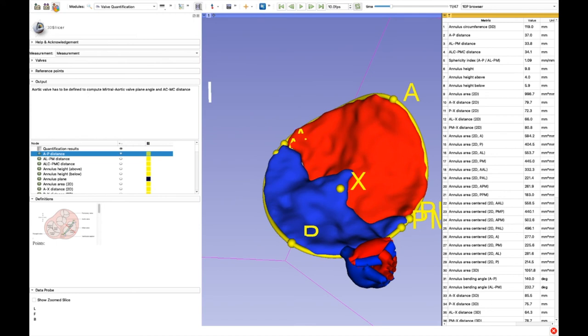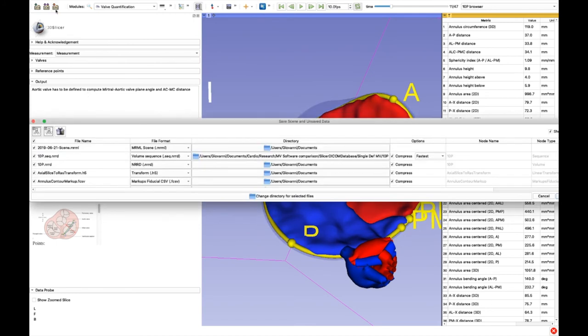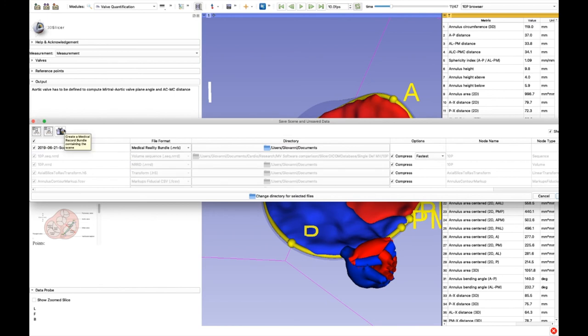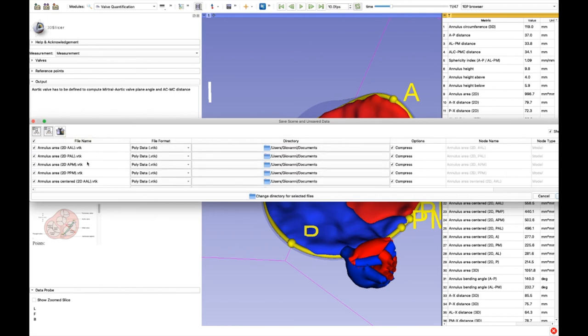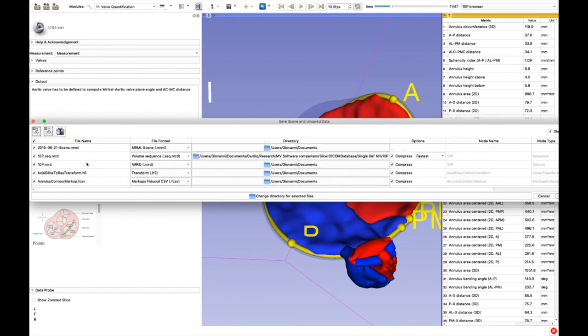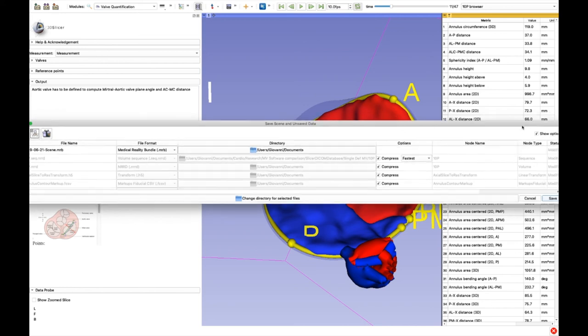All the segmented components of the valve can be saved independently or as a single file by clicking on the Save button.